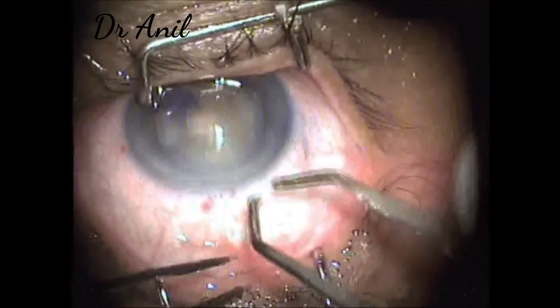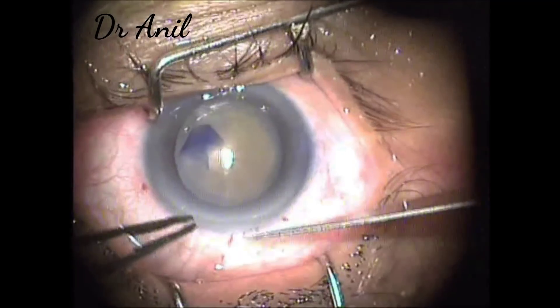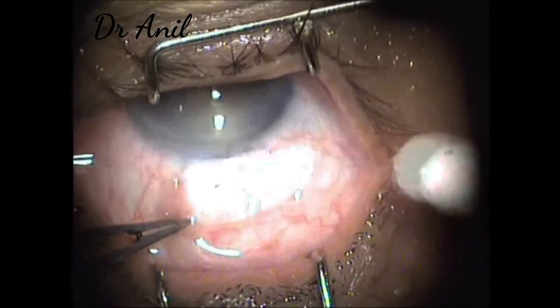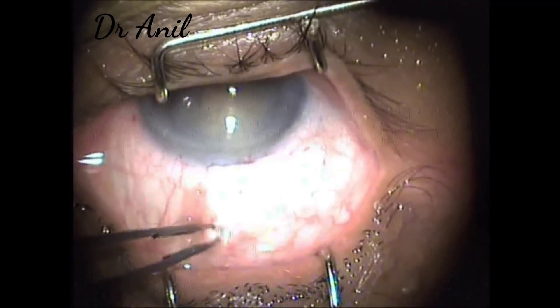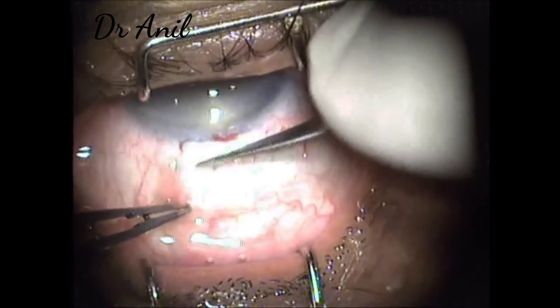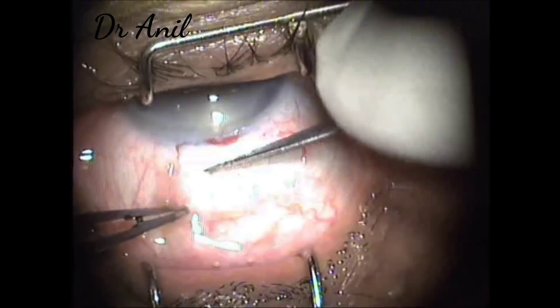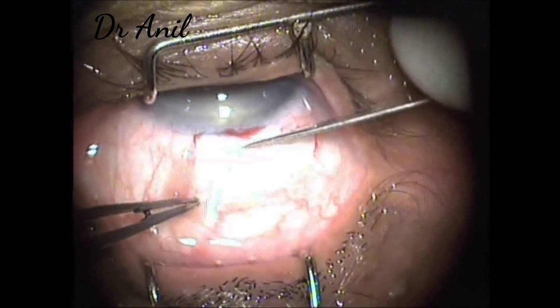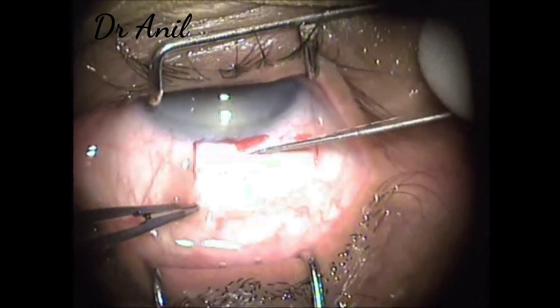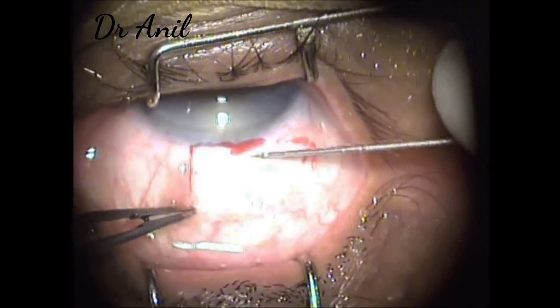Now the incision of the sclera is made — a frown incision is made with an 11 number blade, just a little deep so that it makes a groove in a frown manner. You can even fashion the groove a little more if you require.